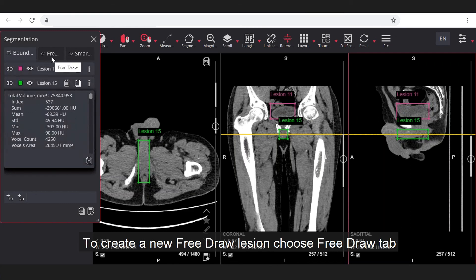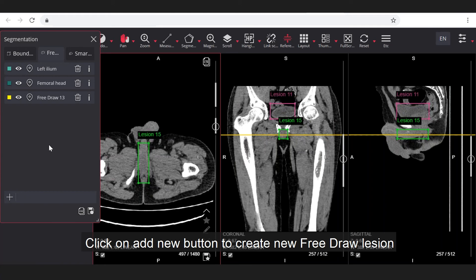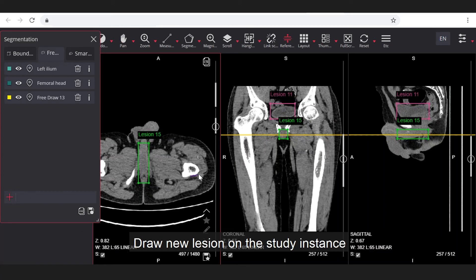To create a new free draw lesion, choose free draw tab. Click on add new button to create new free draw lesion. Draw new lesion on the study instance.